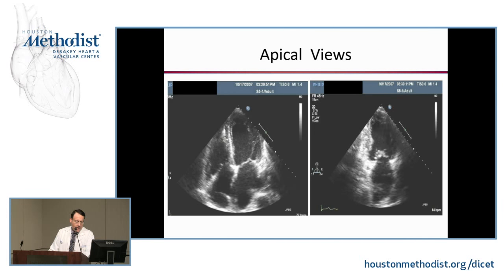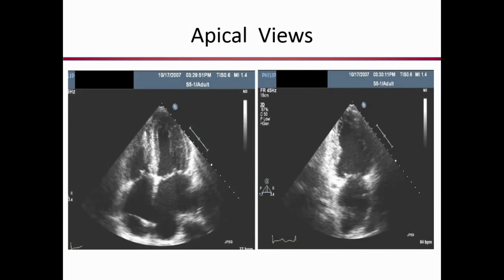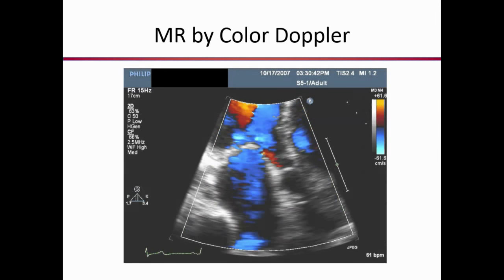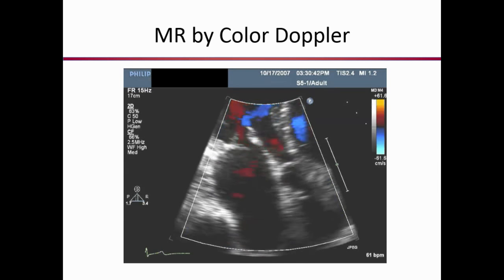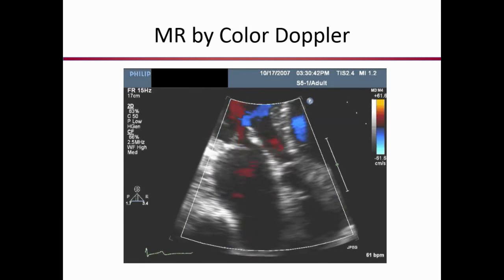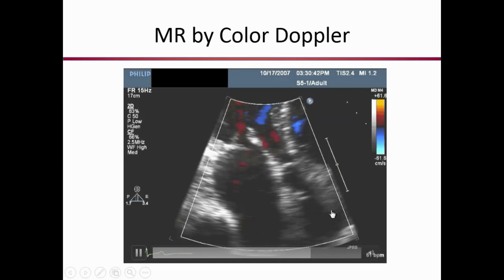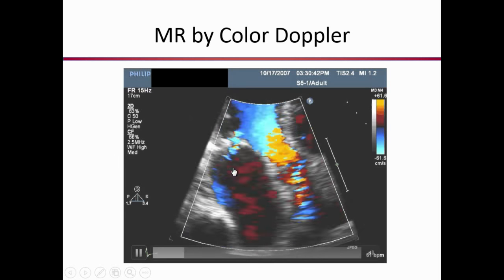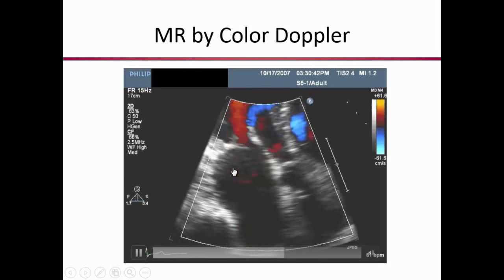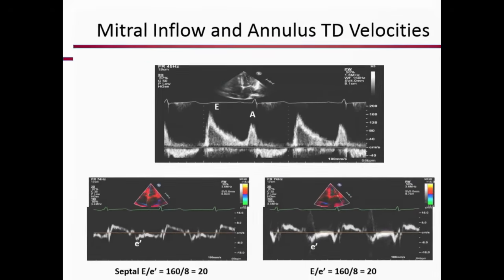When we look at the apical views, apical 4 and apical 2, you have pretty big atria, but LV volumes look normal. LV ejection fraction looks normal. We want to look at regurgitant lesions because regurgitation can affect the mitral E velocity, can affect the decel time, and so on. And not much of a regurg there in terms of aortic or mitral. Clearly you want multiple views. It is not just this view, but I chose this for the sake of time.